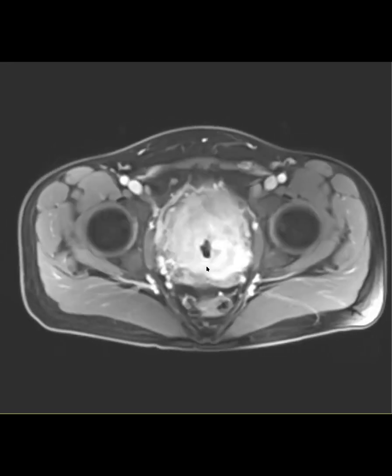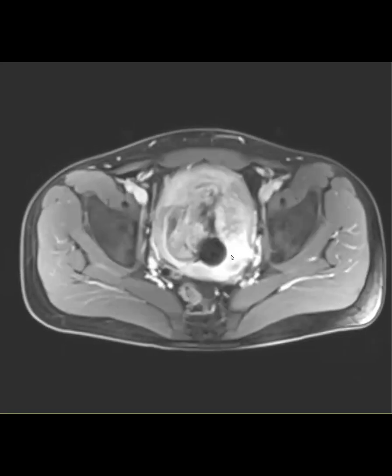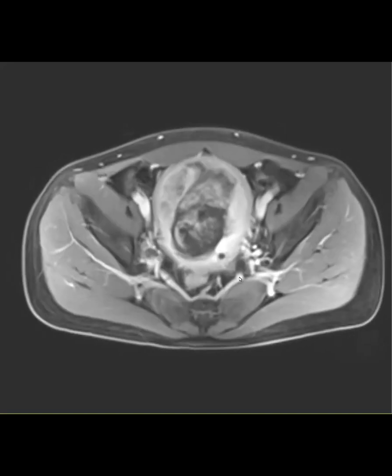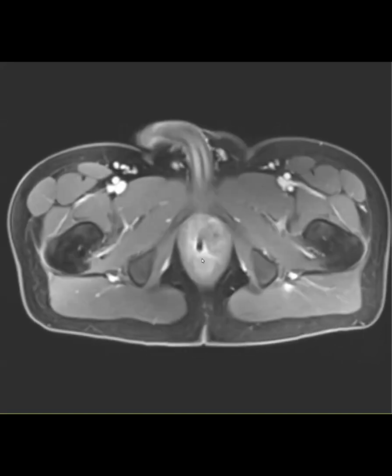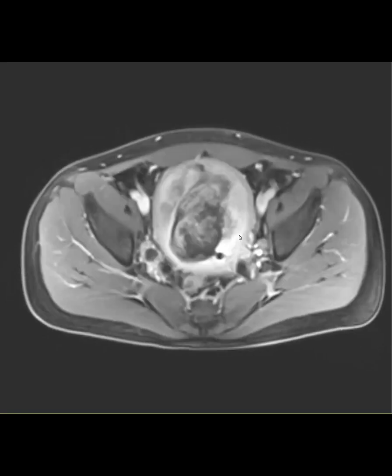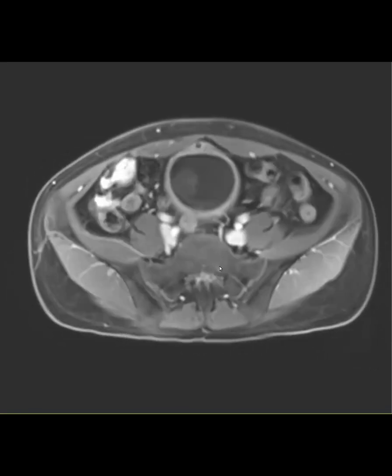But I think there's something about that tissue there, and it arises from the submucosal muscular layer, because that's why it's the myo part, the rhabdomyosarcoma part. So I guess it doesn't truly matter to them which one it arises from, but basically it's usually the base of the bladder, which is why you can see the top of the bladder is spared here.